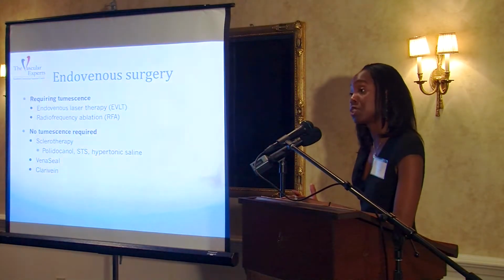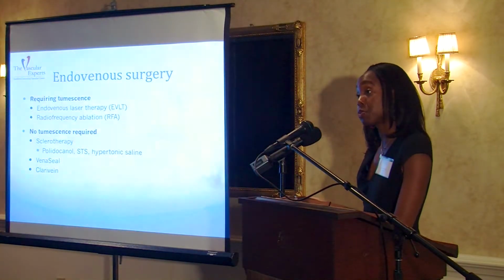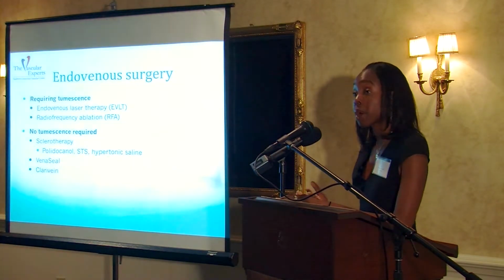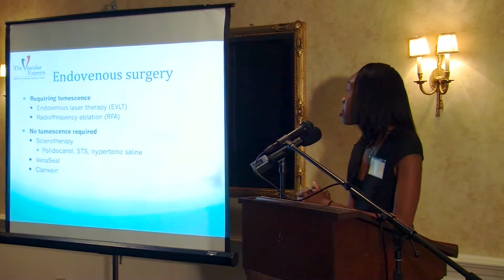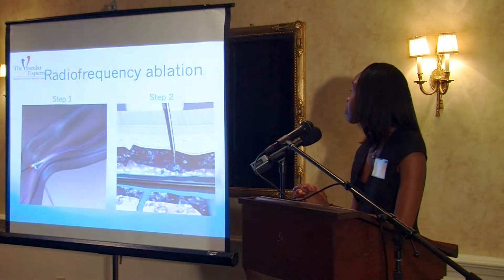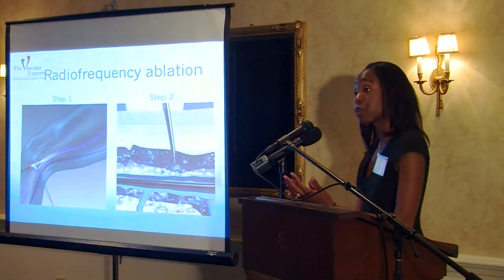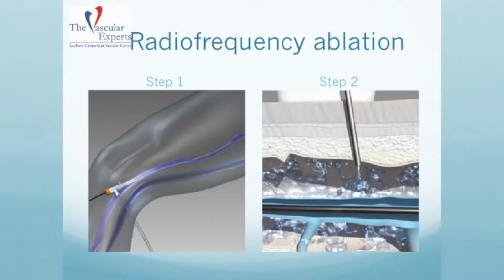So endovenous surgery overall can be categorized into two groups: either requiring tumescence, which is an anesthetic solution which is infiltrated around the vein, or those that are not requiring tumescence. I'll go over both of those. Radiofrequency ablation is one that requires tumescence. The overall procedure is performed very similarly to the laser therapy, so I'll just briefly go over the steps for you.